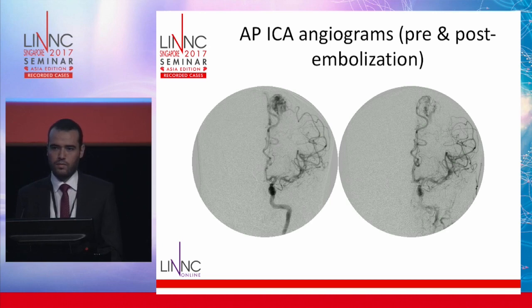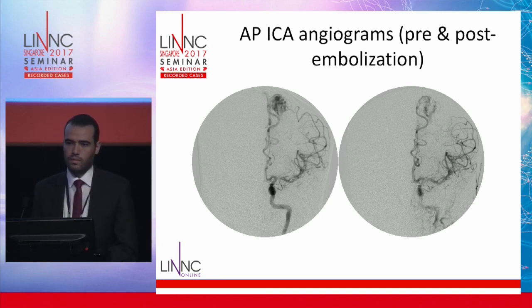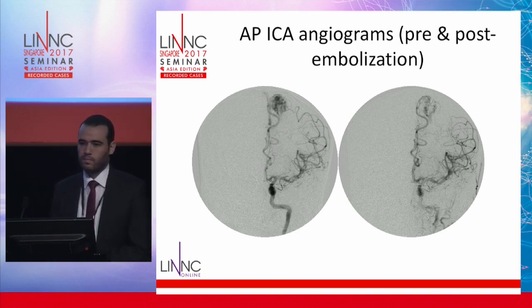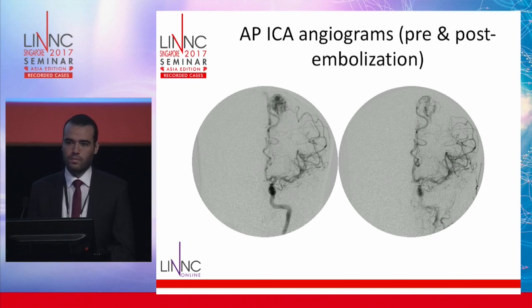There is no bleeding. It means that the embolic agent is going outside the nidus, but at the same time you have a sealing of the leakage. So there is no true bleeding. I know there is no problem from the leakage, but he does not continue embolization of the AVM. He stopped the procedure without finishing all the AVM embolization, only partial embolization of the AVM.